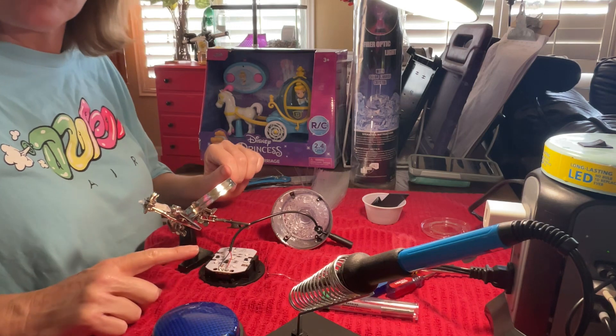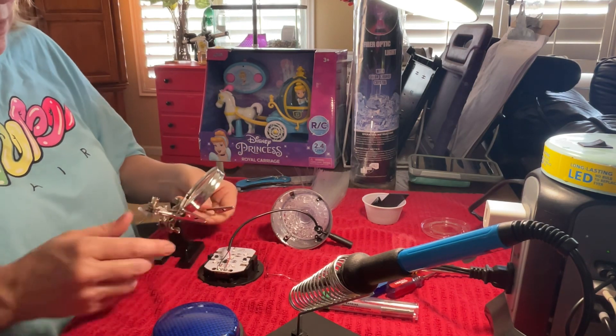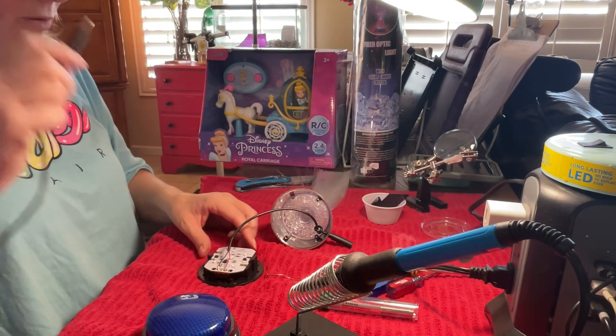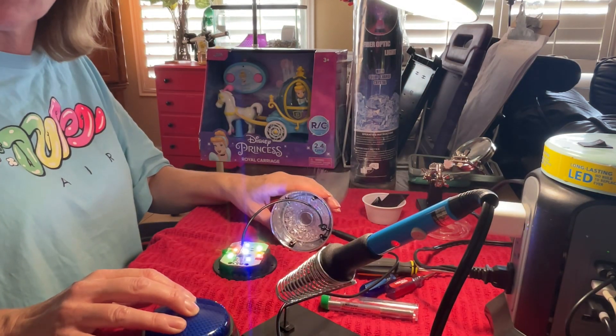Before we put it all back together, we need to test it and make sure it's sturdy. So let's go ahead and plug in our switch, position that — and there we go.